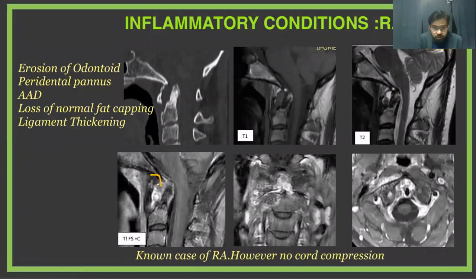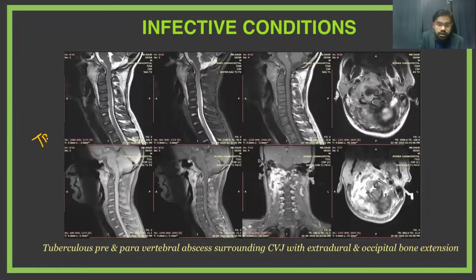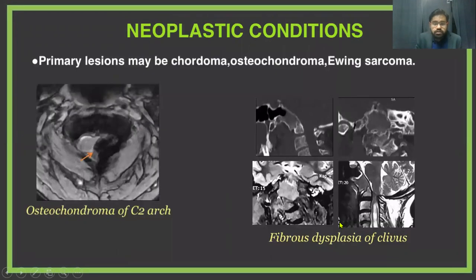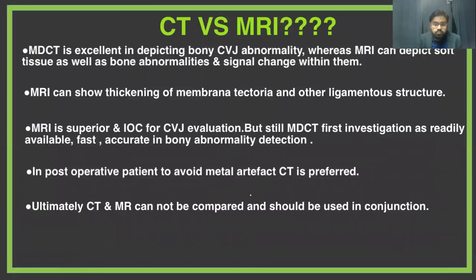This is an inflammatory condition — two patients had rheumatoid arthritis. You can see pannus formation which is enhancing on contrast study, and there is erosion of the dens vertebra as well. Coming to infective conditions, only one patient was present — this is tuberculosis showing pre- and paravertebral abscess which is enhancing, with occipital bone extension. This is a neoplastic condition, not common in our study; this is an example of osteochondroma of the C2 arch. This shows rotatory atlanto-axial subluxation on 3D CT imaging, with asymmetry between the dens and the lateral masses of the atlas. In conclusion, both CT and MRI should be used in conjunction, as CT provides better bony architecture while MRI provides better soft tissue detail.